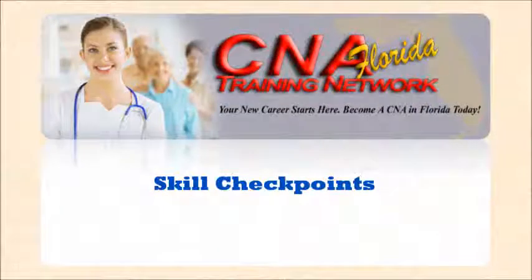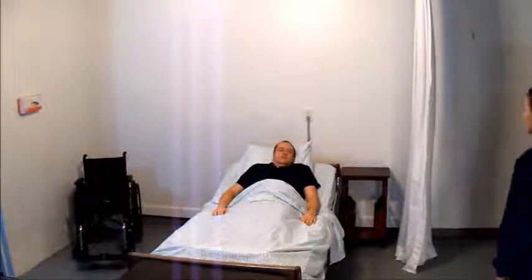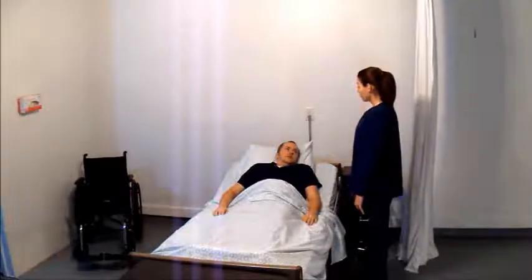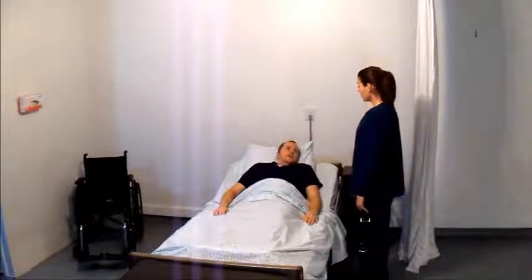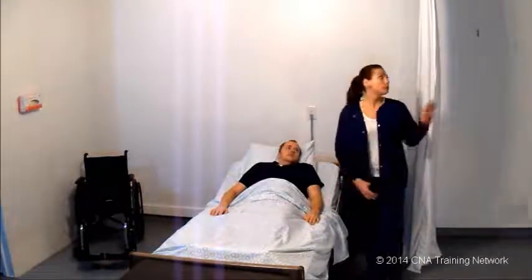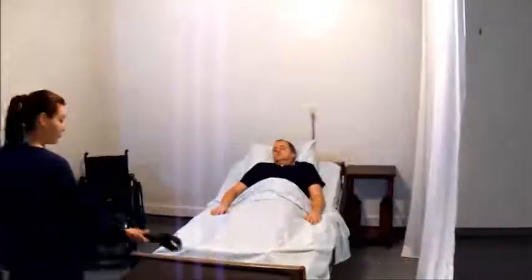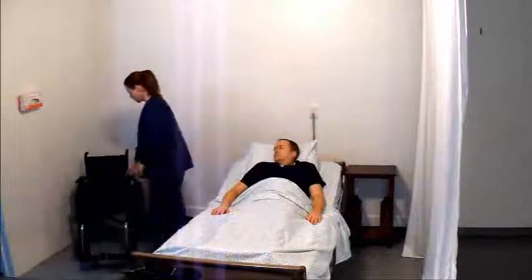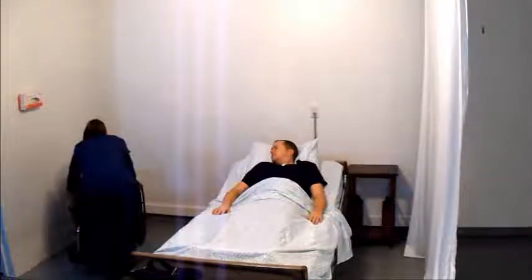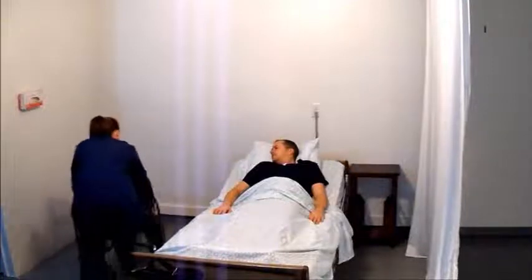Skill checkpoints. Does the candidate greet the resident, address by name, and introduce self? Provide explanations to the resident about care before beginning and during care. Place the wheelchair near the resident's bed before assisting the resident to sit at the edge of the bed. Move the wheelchair footrest out of the way before standing the resident for transfer. Place non-skid footwear on the resident before standing the resident for transfer. Provide support to assist the resident to a sitting position on the side of the bed without pulling the resident by lower arms or hands.